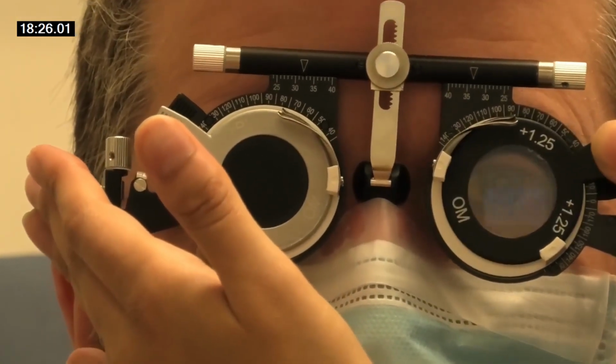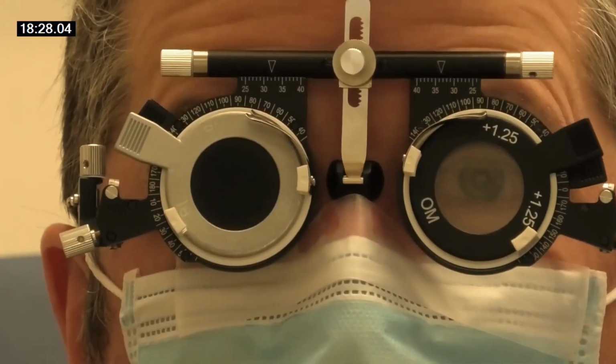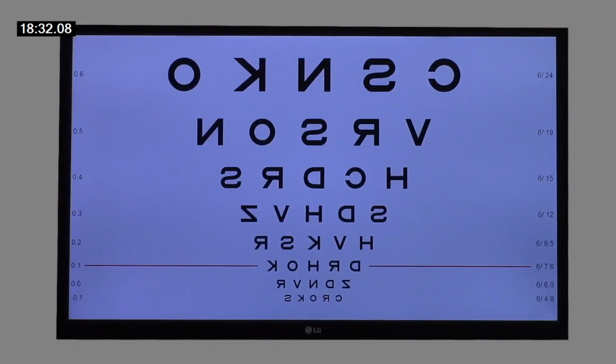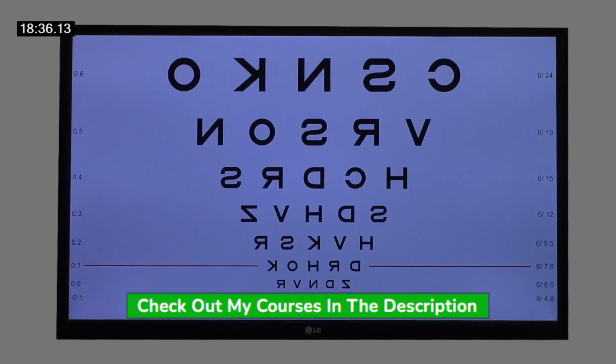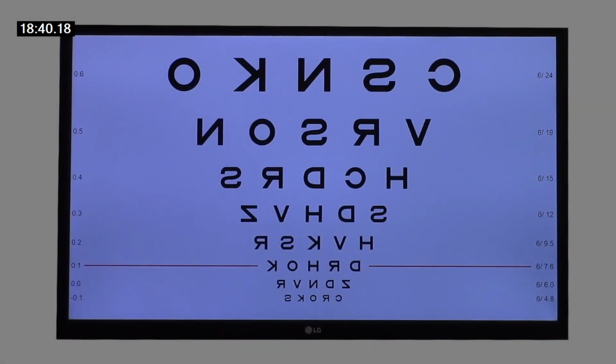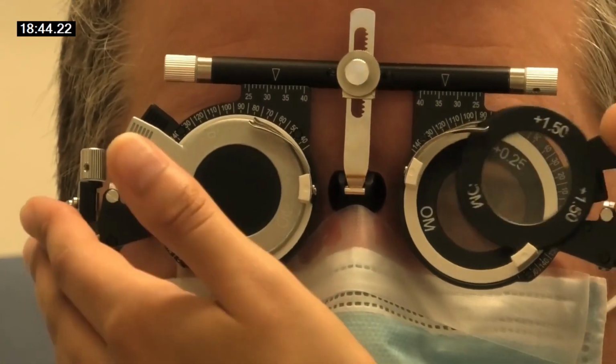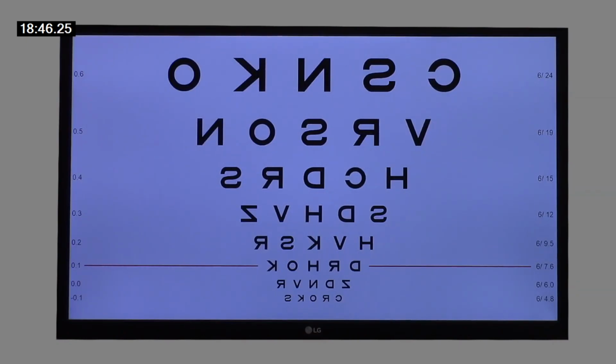Is that a bit blurry now? Yeah, that's blurry. And what's the smallest line that you can see now? The 5th one down, I've got HVKSR. Yeah, so you might want to blur it a bit more then actually. So probably a bit more blurry. Is that better now? The third one down really. HODRS.